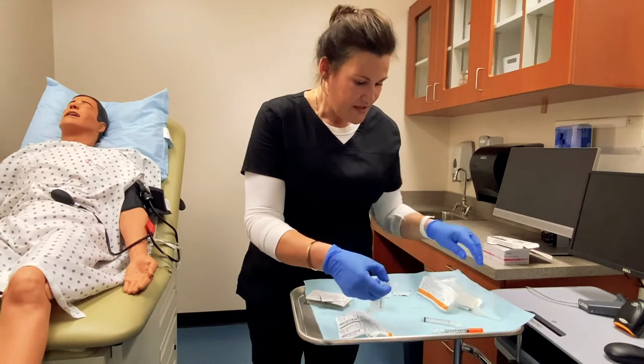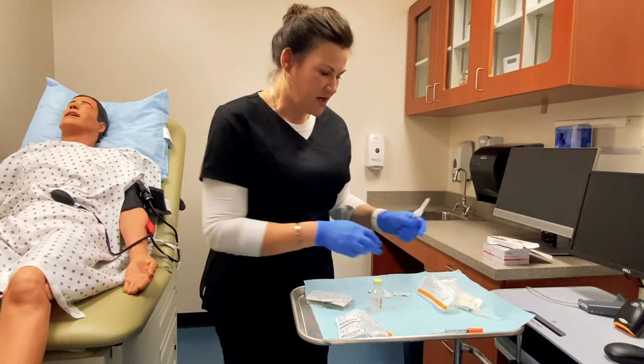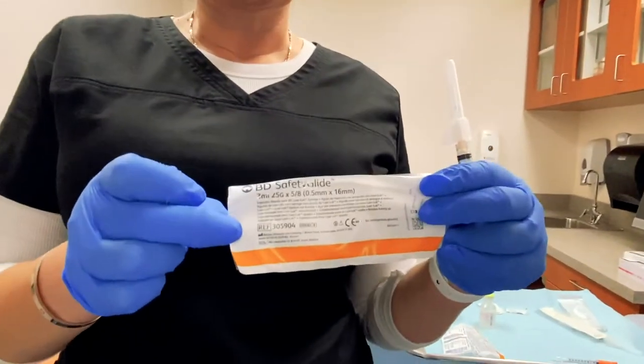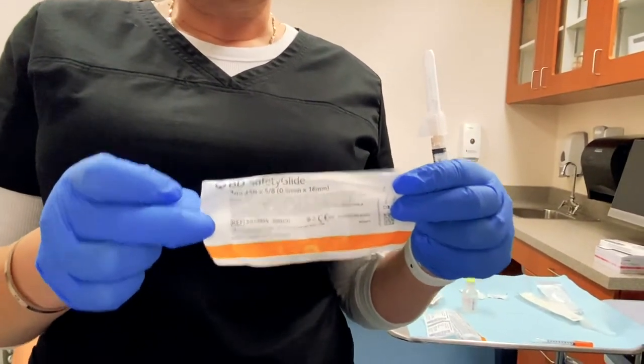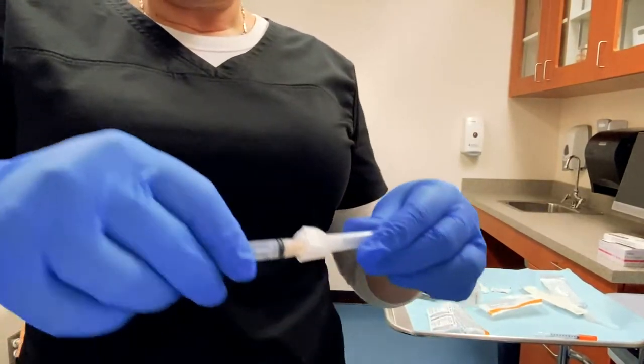The next size needle we have is our subcutaneous needle. These needles are 25 gauge, so they are a little bit bigger than those TB needles, and they are 5/8 inch in length also.